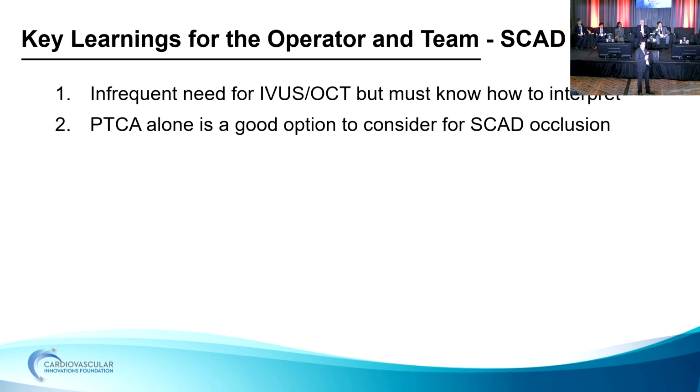So I did that. And second, once you've established your true lumen, I think stenting has not worked in the past because we didn't understand the pathophysiology properly. If you evacuate the hematoma, if you release it, then you have the option to stent or not afterward. When you've established your true lumen wire, you have multiple options. You can go into the false lumen, you can aspirate blood from the false lumen, you can STAR down because you have protected your LAD.